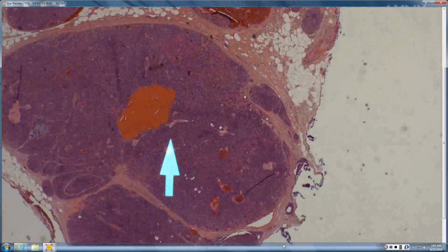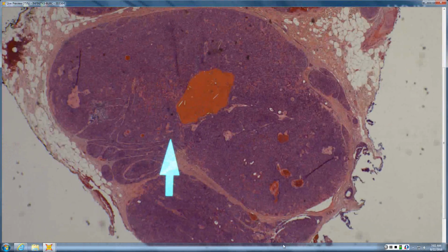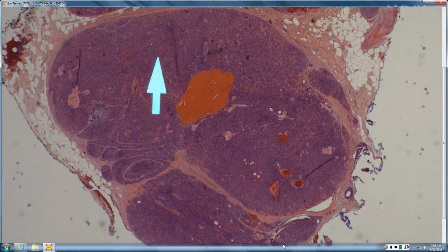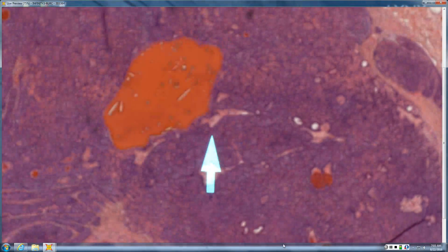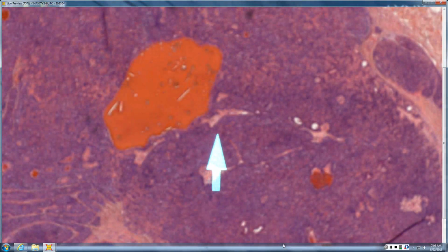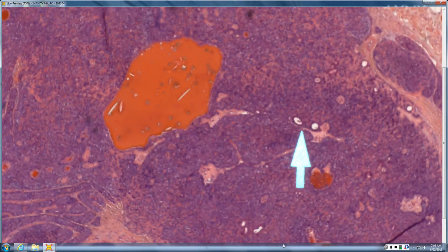Okay. So this one is the spiradenoma. And so similar to that cylindroma, you get the little hyaline droplet formation. And that's kind of what clues you in here, because this is otherwise just this really big kind of bluish nodule or blue ball in the dermis. And once you get in closer, though, you can start to see all those little hyaline droplets. And if you get in really close, you'll see actual little duct formation as well.